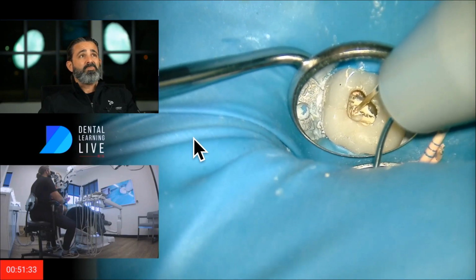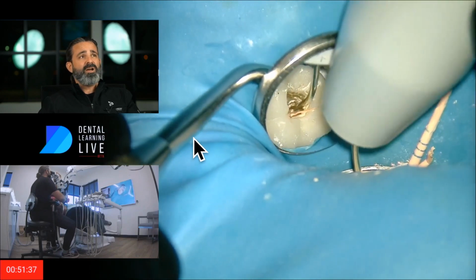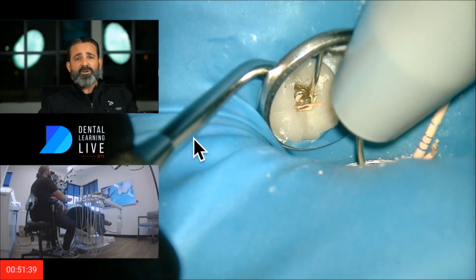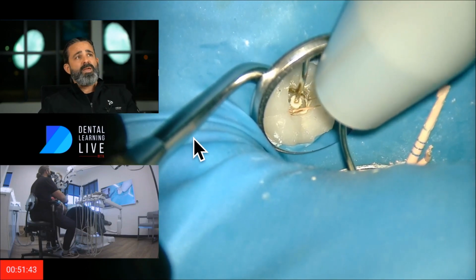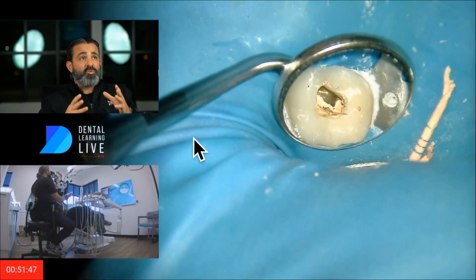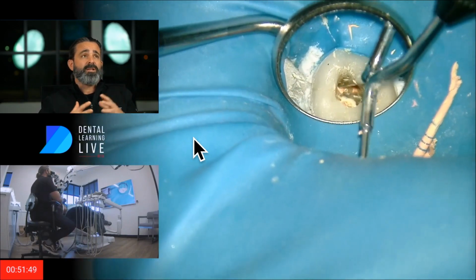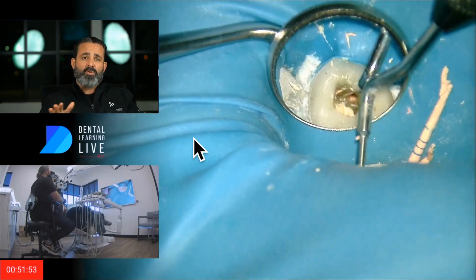And I'm doing more of a cold technique, cold condensation, because I'm getting a true fit of a cone. I'll backfill the whole way up, and then I'll place a fitted cone that's a true fit, meaning it's really intimate. That shape and cone are married. And then I sear it off at the orifice and do a cold down pack.